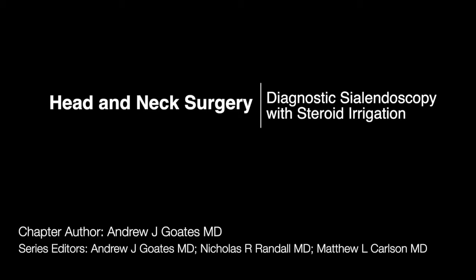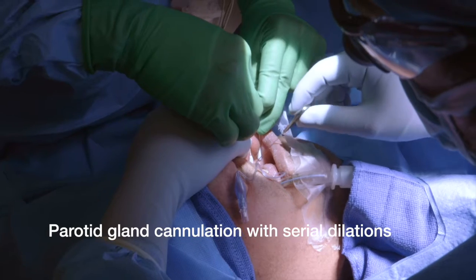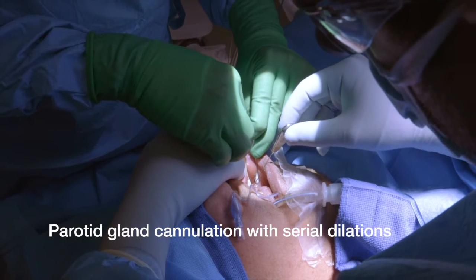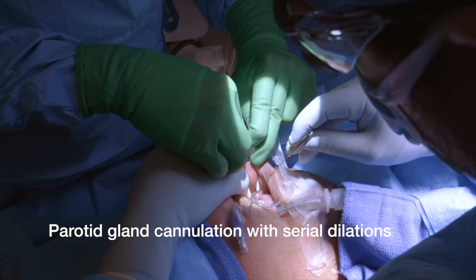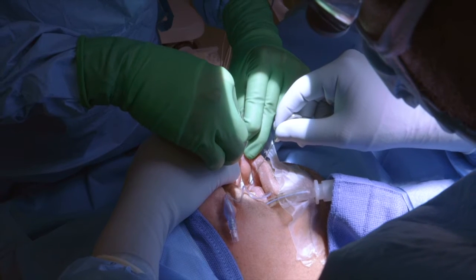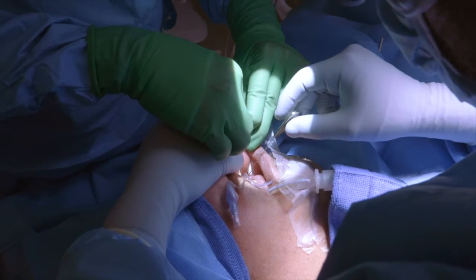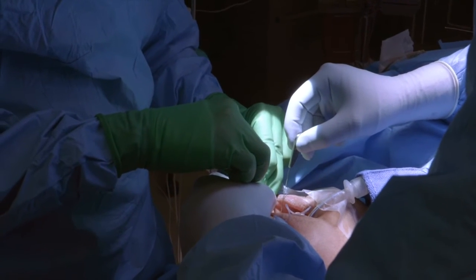First, we will discuss cannulation and dilation of the parotid duct using the serial dilation technique with lacrimal probes. The parotid duct opening is quite reliable within the buccal mucosa, and it opens into the mouth opposite the second upper molar. The non-dominant hand should be used to put the buccal mucosa on tension with gentle retraction anteriorly and laterally, and the papilla should be visualized. We tend to do this under loop visualization; however, the use of a microscope is also commonly done. Once the papilla is visualized, cannulation proceeds with engaging the opening. I like to do this with simply the weight of the lacrimal probe providing the pressure, in order to reduce the risk of perforation.